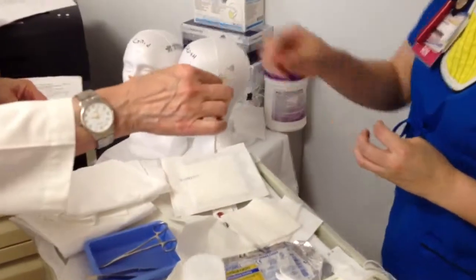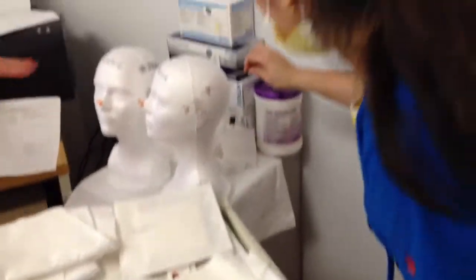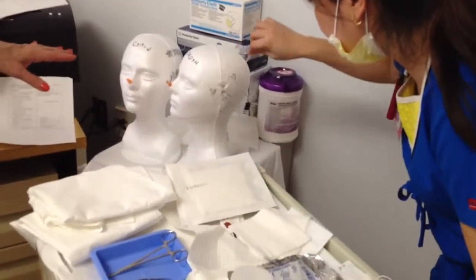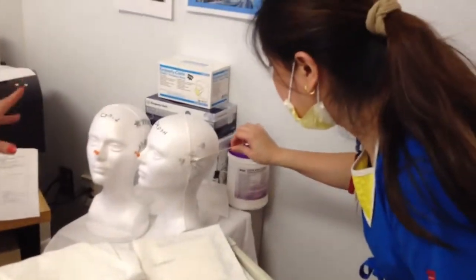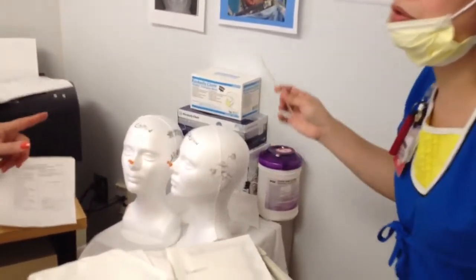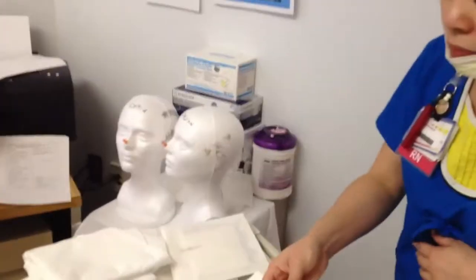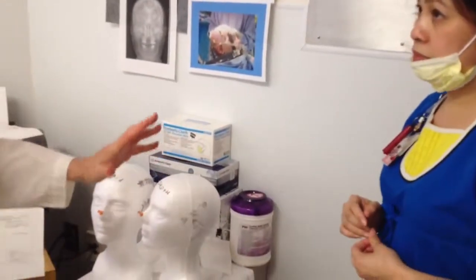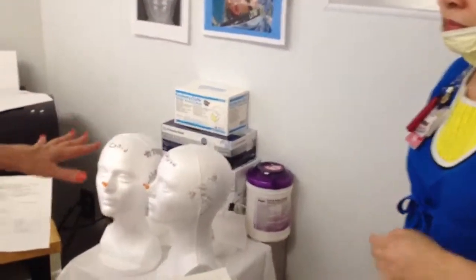This is your beta-dine. You're going to go clean around each of them — one Q-tip per hole. For each hole, one Q-tip per hole. That's why you need a lot. So at least you'd have to have 8 to 10 plus. So now, let's do it.